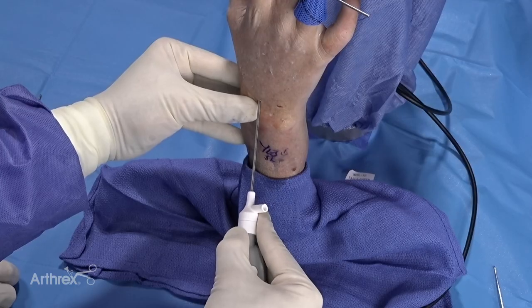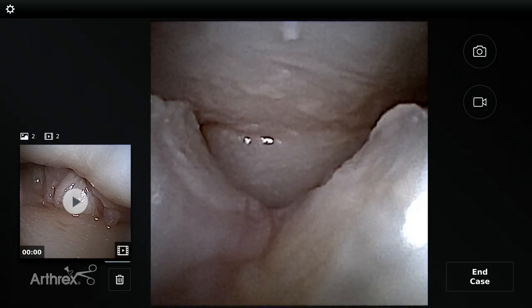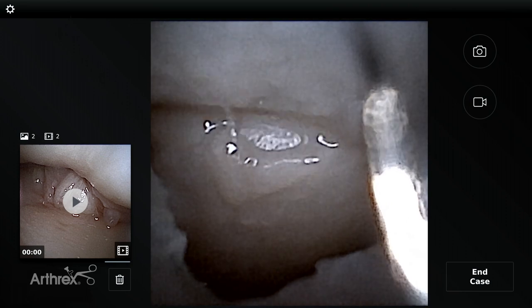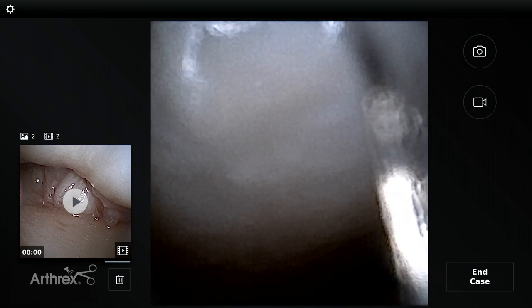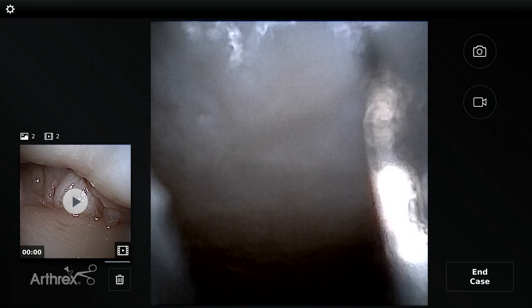The nanoscope is conforming to the tight space, going across the scaphoid. Now what we can see is the trapezoid above us, and palmarly the trapezium. This patient has a degree of wear into the trapezium — invaluable information when we're planning therapeutic procedures for the basilar thumb joint, if clinically indicated.